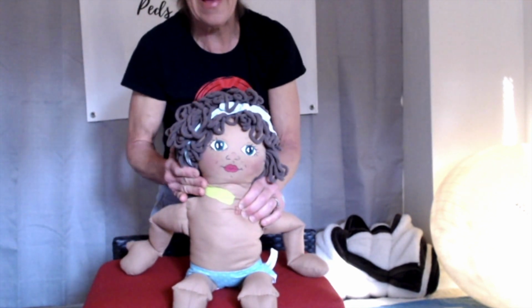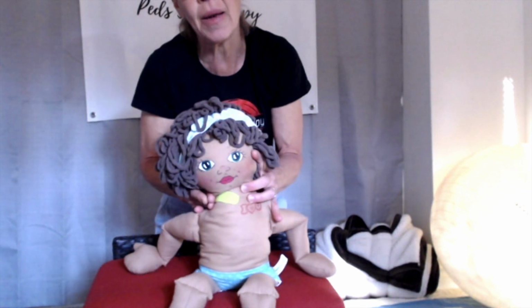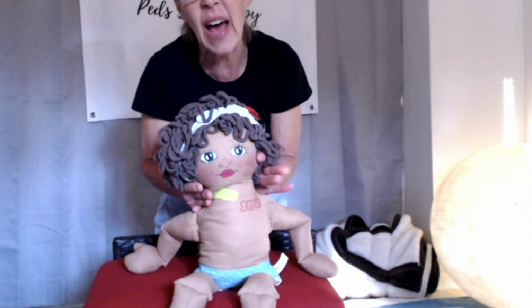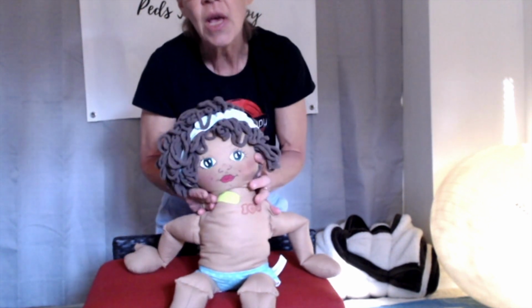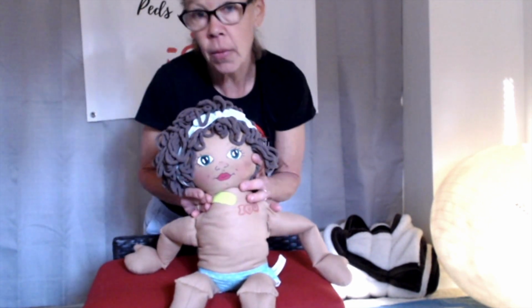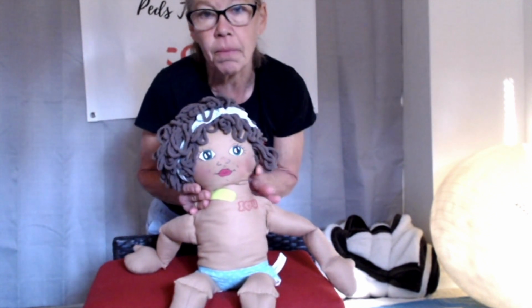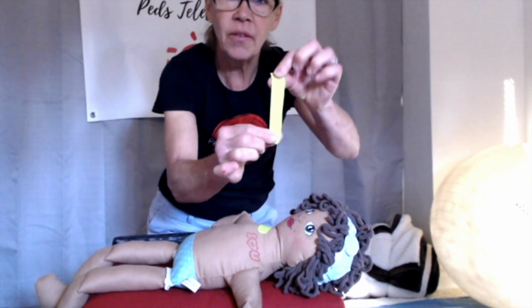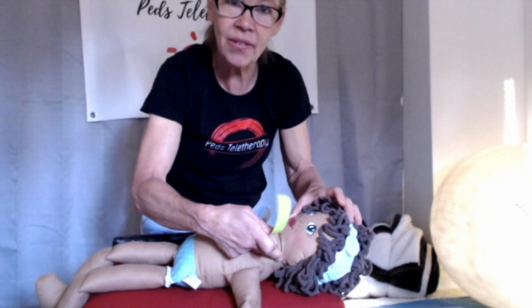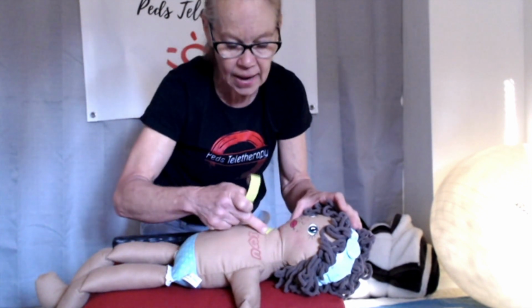We're relaxing this side, but now we want to turn on this side. If this side's tight, the assumption and most common thing is that the other side is actually not pulling enough to get that neck over here. It does no harm to tape something assuming it's weak, if it's not going to do anything bad to it. So to tape that side, I'm going to lie that baby down. Here's my little test strip. I want this left side to turn on more. Origin starts with an O, on.